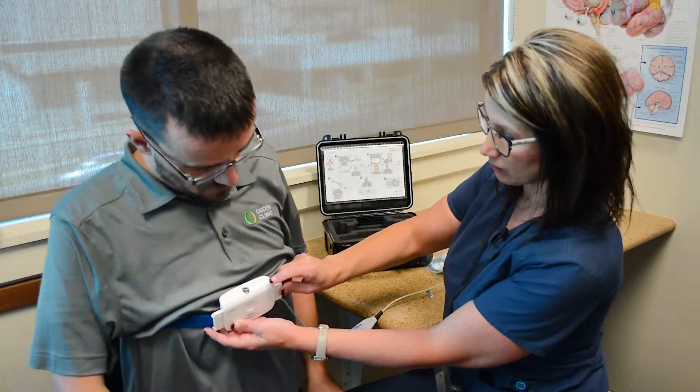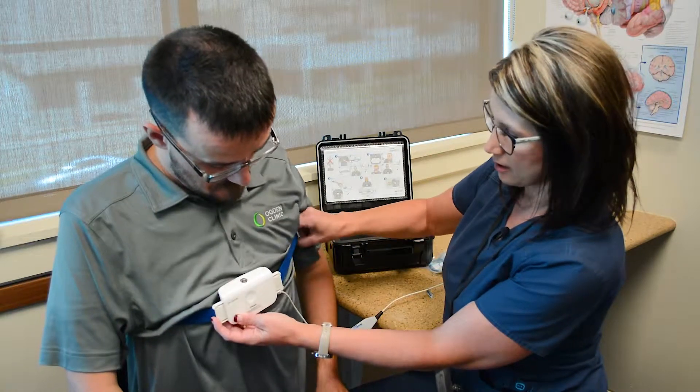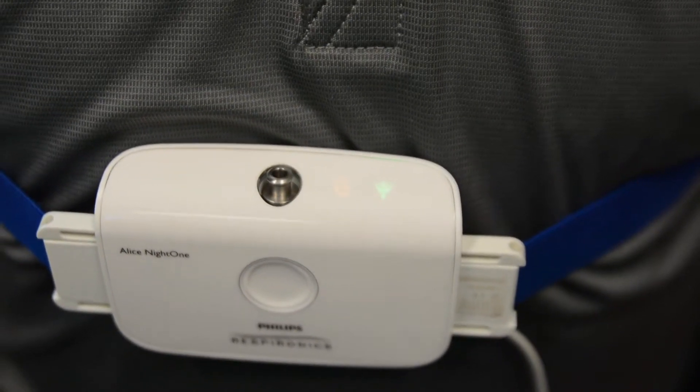We have the indicator here — we're going to wait for it to turn green, and then we move on to the next sensor. It's green now, so we're going to move on to the cannula.